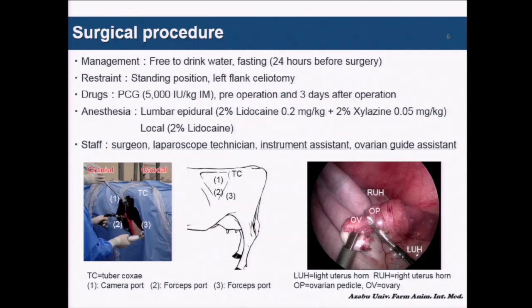After anesthesia, the mesovarium was cauterized and ablated from its end. While confirming that there was no bleeding from the ablation site, we extirpated the ovary from the intra-abdominal space. The ovary on the other side was removed with the same procedure.